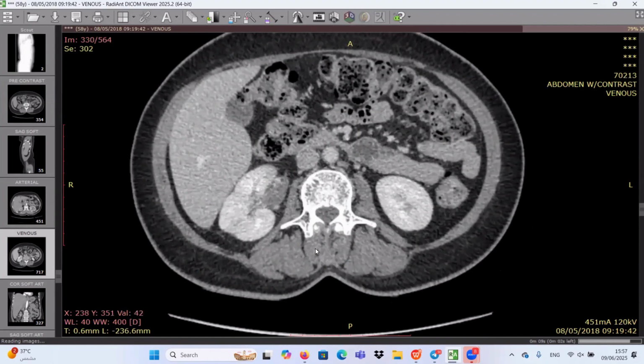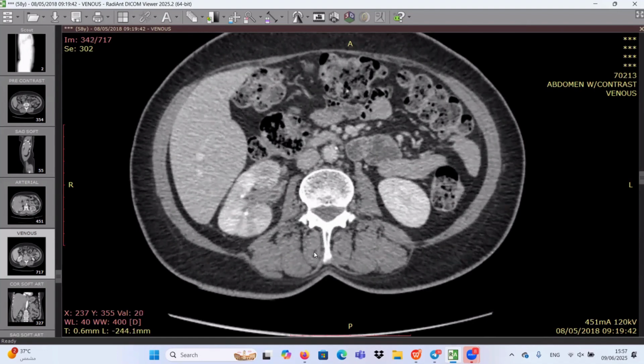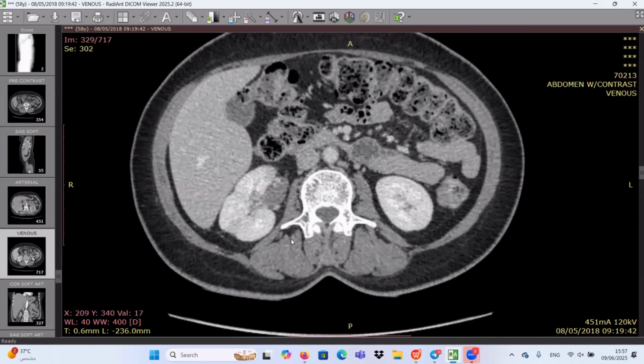What is the cause for the blood clot for this one? How can we explain the cause for the blood clot? Is it logic to be renal infarct with blood clot, or acute obstruction secondary to blood clot?